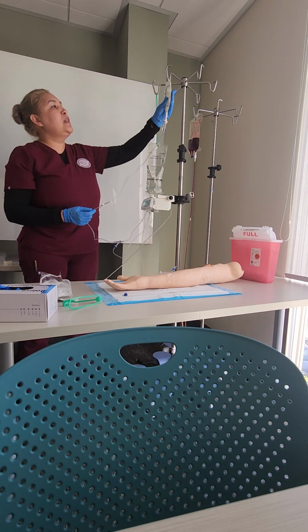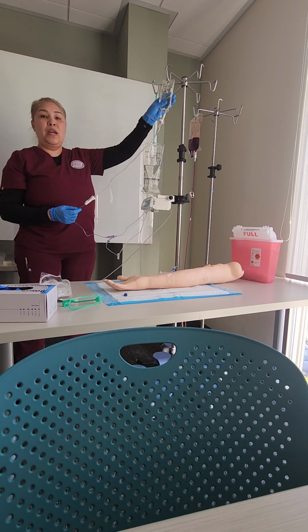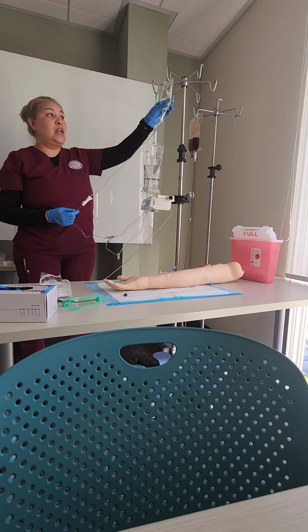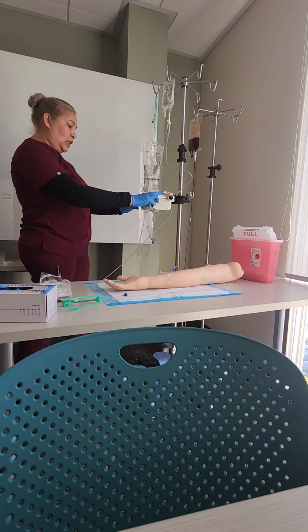My bag is 100 mLs, but we want to infuse it faster, so we're going to set it at a 200 mL rate, and then it's going to go for 30 minutes. So let me set that up.